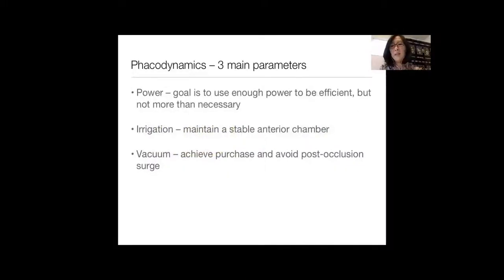So today I'm going to be talking about a little bit of a variation on what I had announced, and that is I'll talk about 4 topics today. The first is going to be phaco-dynamics. We'll talk about viscoelastics and your access to consumables and the importance of making certain choices. We're going to talk about biometry and choice of intraocular implants. And then lastly, I'll talk about the small pupil, use of rings for the pupil and rings for the capsule.